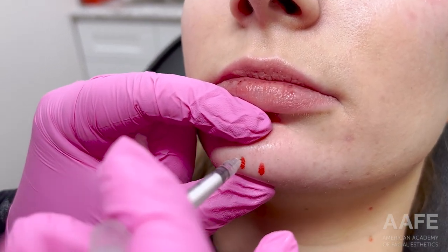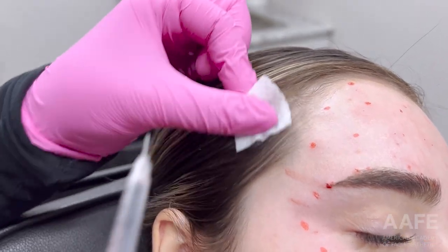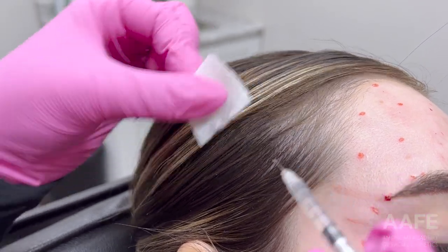You can see I just treated her nasalis — those two injections on either side of the nose — then moving down to her mentalis, right into the beefiest part of that muscle. She's kind of a unique case when it comes to pain management.